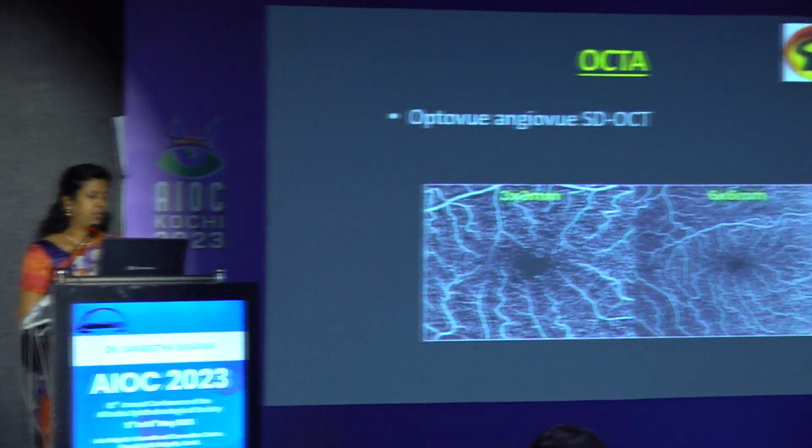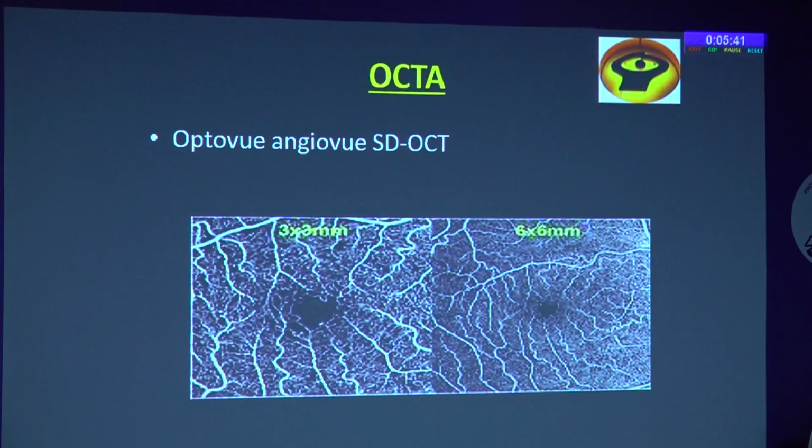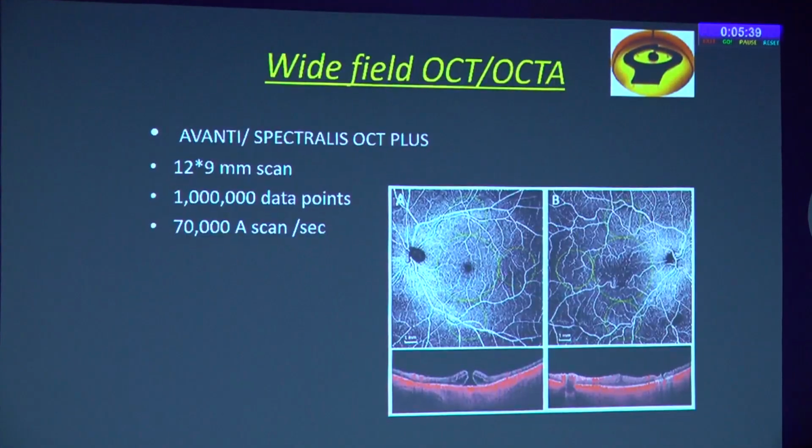So, for the past 2 decades, we have seen tremendous development in the field of posterior segment imaging, especially OCT, which started with time domain, now spectral, then the swept source and the OCTA. When OCTA was first new to us, it came in the form of OptoVue AngioVue, which had a 3 x 3 mm slab and a 6 x 6 mm slab.